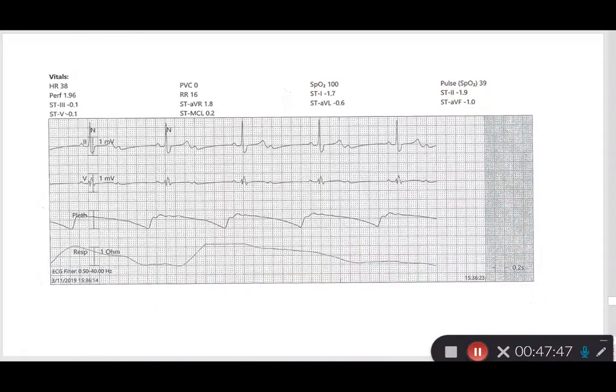Alright, got another one for you here. And then we just have a very interesting case to look at the end. So I can already tell it's kind of a heart block because it looks very bizarre. I definitely have more P's than Q's. Alright, so could it be a first degree? No. My PR interval actually looks pretty good. It's only 4 or 5 blocks. So it cannot be a first degree, plus I have more P's than Q's.